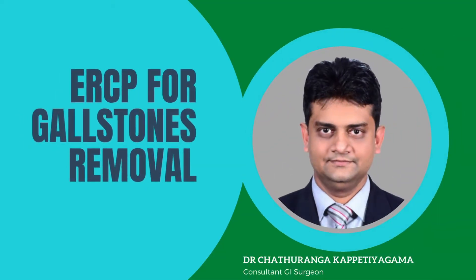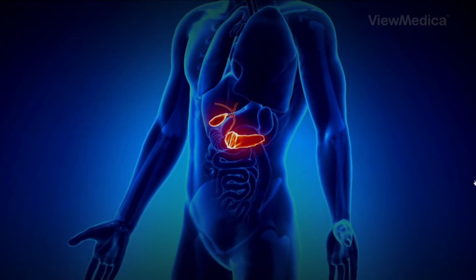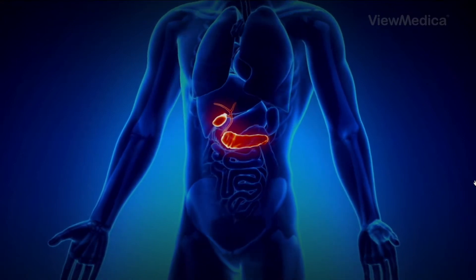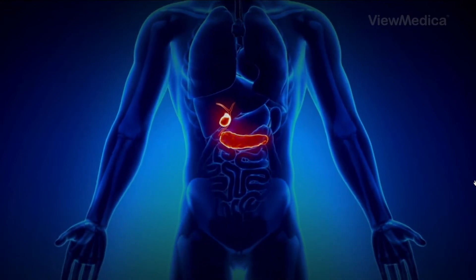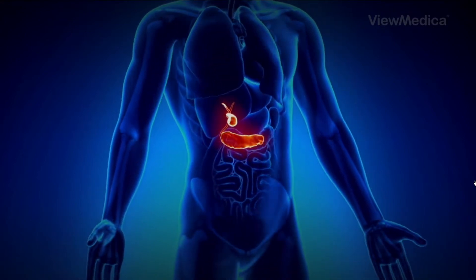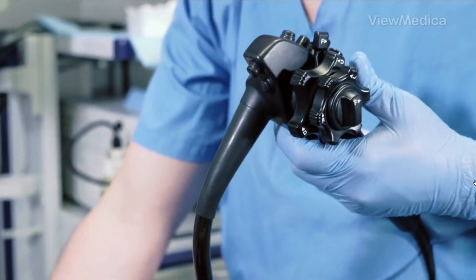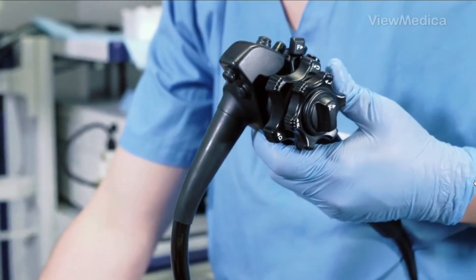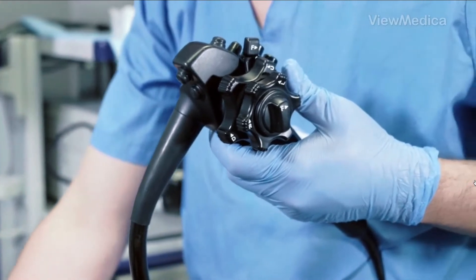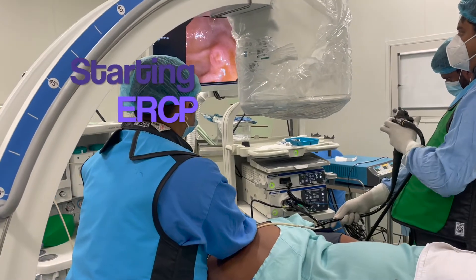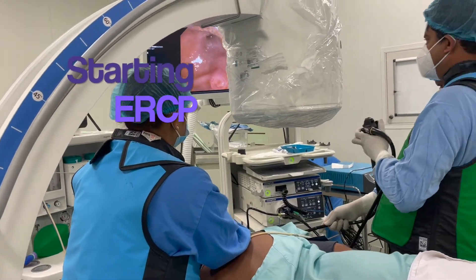Dr. Chaturanga Kapatiyagama, consultant GI surgeon in NHK Sri Lanka, is performing an endoscopic retrograde cholangiopancreatography to remove a gallstone in the common bile duct, as shown in this video.